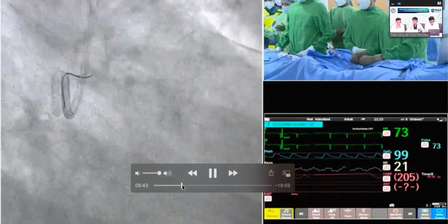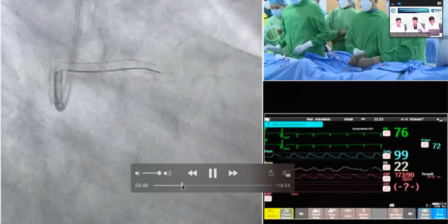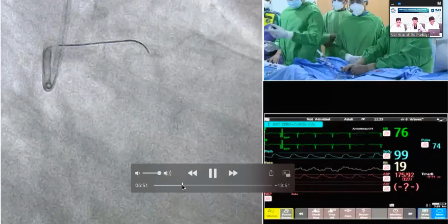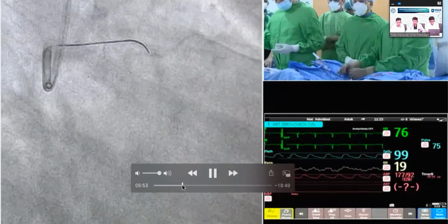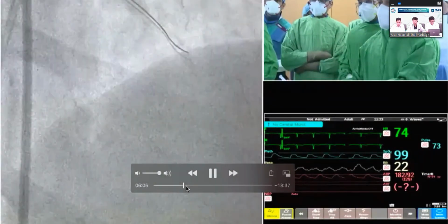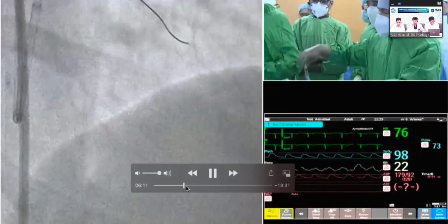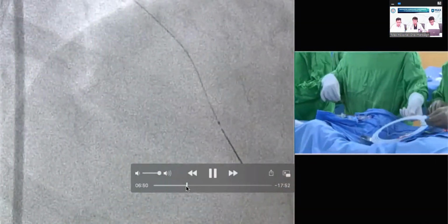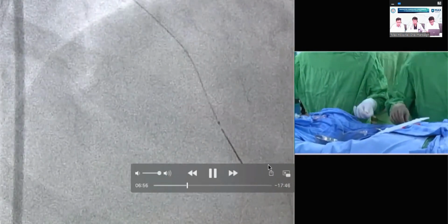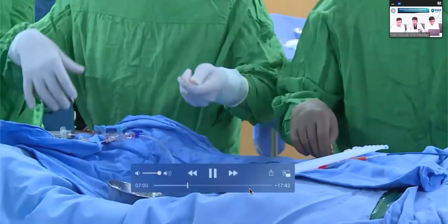If you see the hemodynamics, the patient has a pulse of 73 per minute, pressure 170/90, saturation 99, so overall the hemodynamics are good. We are into the LAD and have crossed the lesion with the workhorse wire. The radiopaque portion of the wire is around 27 millimeter here. So we estimate the lesion is around 48 or 50 millimeter, so we need a long stent or two stents. While passing the rota wire, we should be very careful that it does not kink, because if the wire kinks, you may land up in trouble while passing the burr.